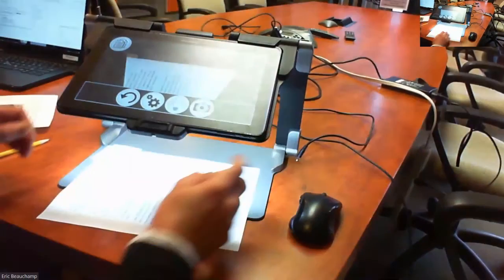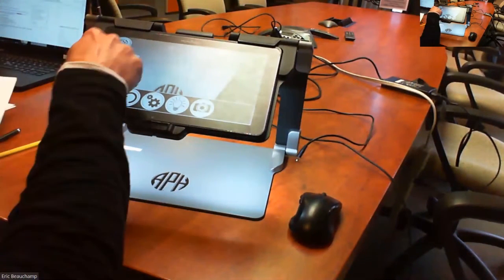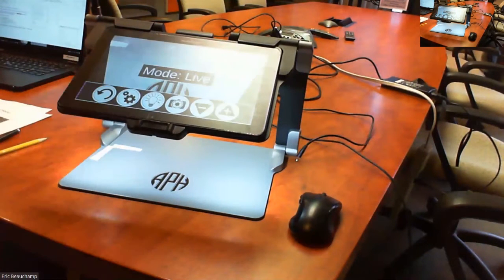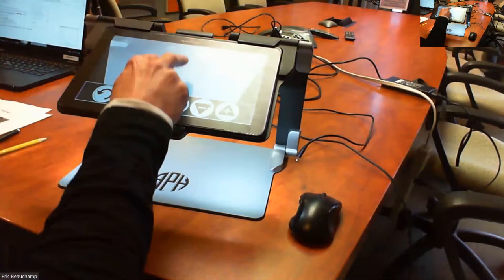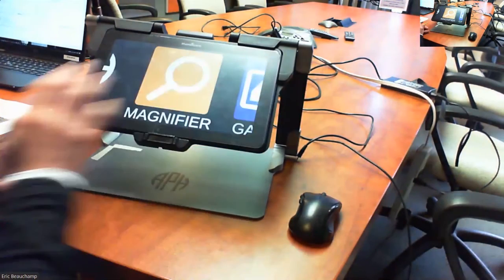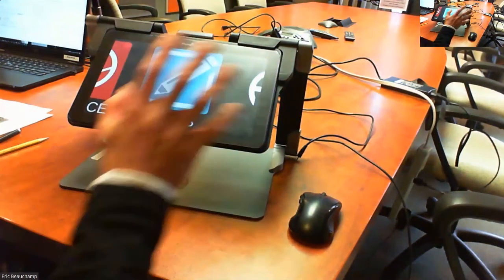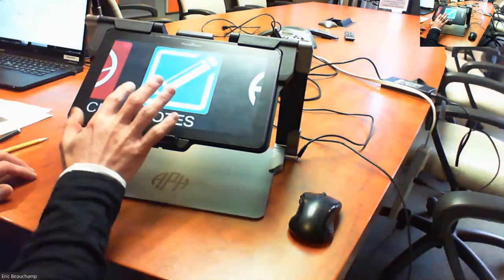Okay. Great. So one of the objectives today was to go from magnifier to distance. So let's try our distance application. One nice little shortcut for you guys is to use 2 fingers. Watch this, 2 fingers, tap on the screen twice, and you'll go back automatically to the main menu. So you're back to where all the big icons are. This is very useful if you're in the settings somewhere, changing the voices or something like that. 2 fingers, double tap, you're back to the main menu.